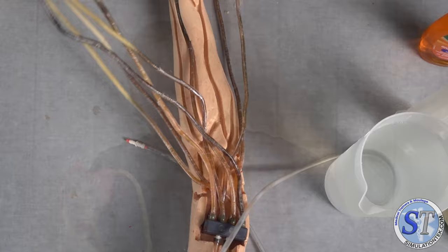Notice this one didn't have any sort of glue holding it. They didn't super glue the veins. They didn't do any of that kind of thing. And that's key. Some IV arms will have your veins glued in, and some people will glue them back in when they're done. I cannot wave you off of that enough, because that's causing you more work later. When you're going to change the veins, you've got to clean all that glue out of the channels and all that stuff. So we've got another trick we're going to get to.